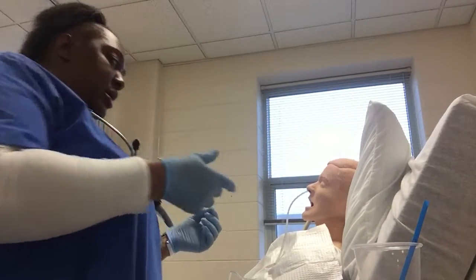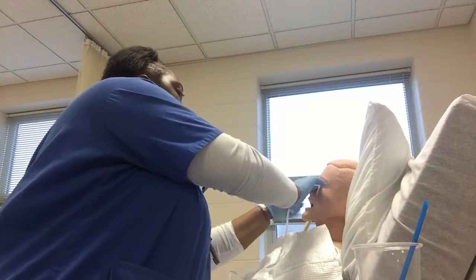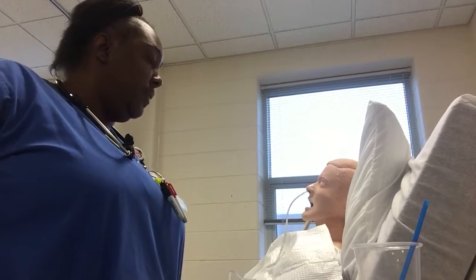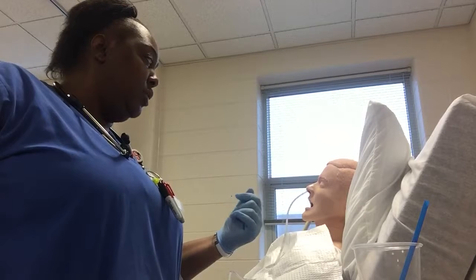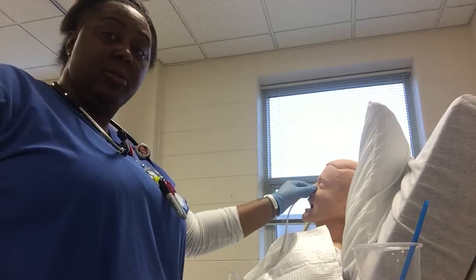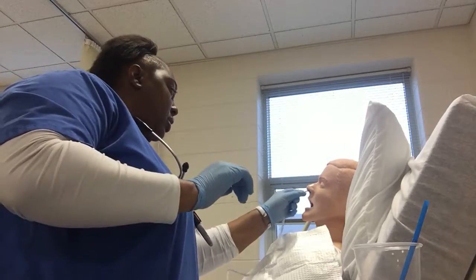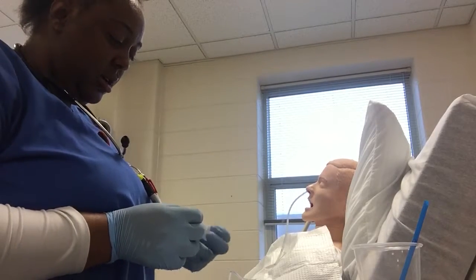Now, the tube is there, then put a piece of tape on the nose, and I will check the placement of the tubing. You check that by x-ray. It is the most proficient, and if you can't do x-ray, then you'd use a syringe, and then you test for the pH, and I'll do that in just a second. So if that were to go all the way down, which it is not doing currently.